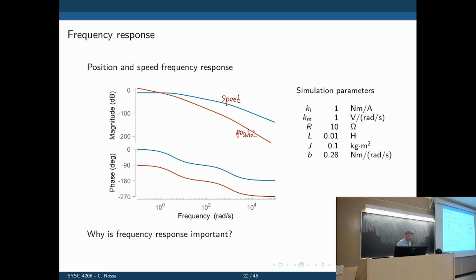You can think about a very simple simulation. You have a surface like this, and you want your end effector to move downwards along this surface. So as it moves downwards, you have spikes of force and no force like that. So you have to turn it on and off, on and off. Apply a force, not apply a force. And if you have all the dynamics of the system in the way, you can't have a crisp surface feeling like that. You always have some transients, and then the result of your force is something interpolated in the way.